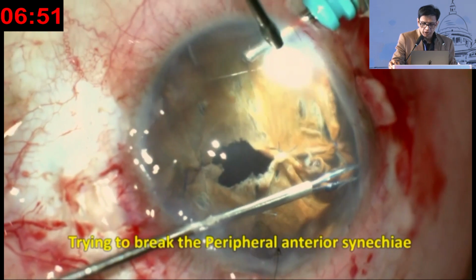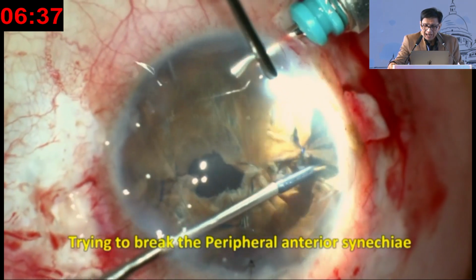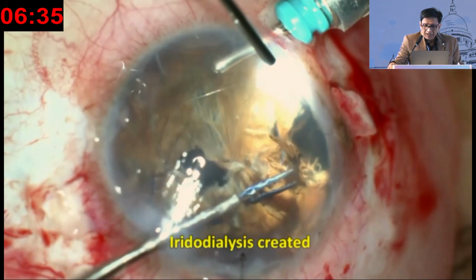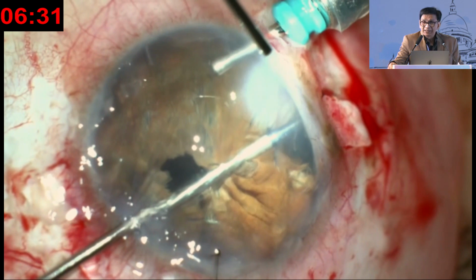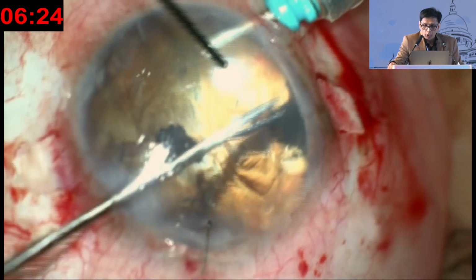Now notice here, there are peripheral anterior synechiae. If you don't break those synechiae, when I'm putting my graft inside, that air will not fill in that particular area. So now my next step is to break those peripheral anterior synechiae, and in the bargain you notice I have created an iridodialysis. I don't mind this because in this case I know if I don't break that synechiae, this patient will never become all right.